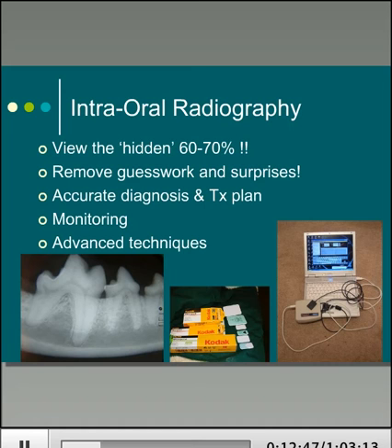So to view those, we need our other imaging, which typically would be the x-rays, of course. And without it, of course, we're guessing. So we end up with difficulty with extractions often because we didn't realise there was an ankylosed root or there was a crack in the root and things like that. And also, we can't really get a diagnosis, and therefore we can't properly treatment plan. So radiography is really fundamental to dentistry.